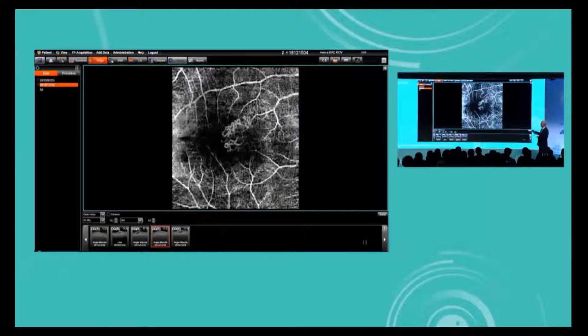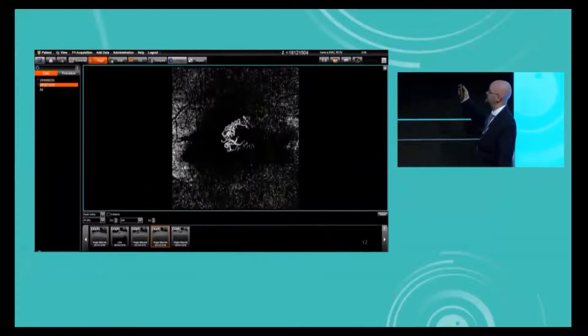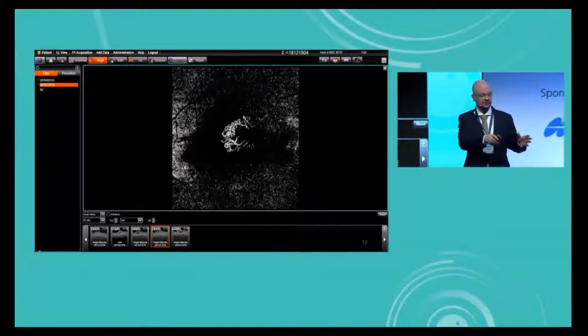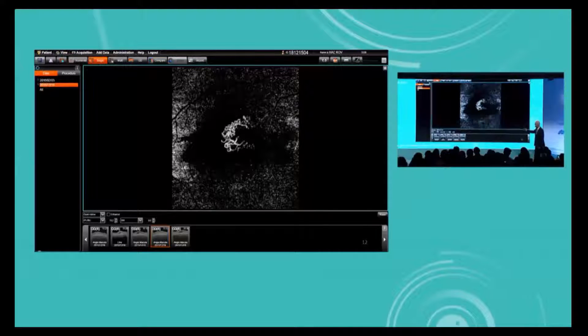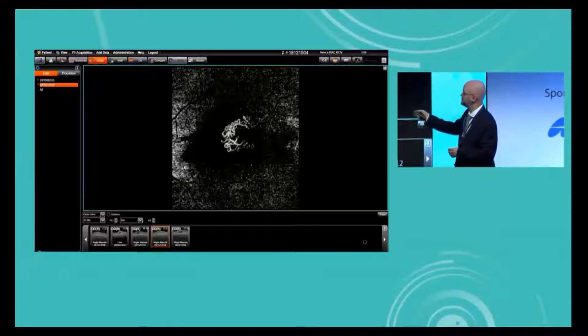If that structure is a fibrosis and you start seeing vessels inside it, you have to look at what vessels are above it to determine whether these vessels are actually real. To address this in the outer retinal layers of a choroidal neovascularization, you subtract the superficial vessels from the outer retinal vessels, and what is left is the real neovascularization. This is not a perfect solution because you also lose some information inside the choroidal neovascularization, but it is possible to really view what's going on.